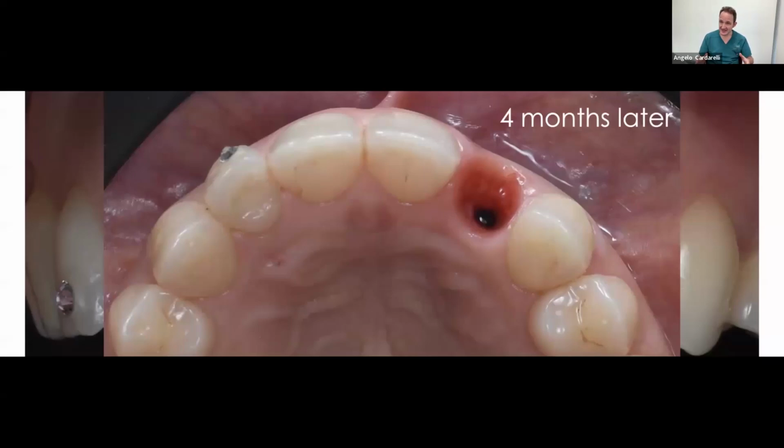Okay, this is amazing, but also very interesting to see the osseointegration, but also the volume. Have a look, the placement of the implant and the amount of tissue that we can have on the buccal side. So, especially in the aesthetic zone, it is mandatory to keep the same volume. So another option, another indication of the ion implant is in the aesthetic area in order to achieve this result in terms of the osseointegration and in terms of aesthetics.